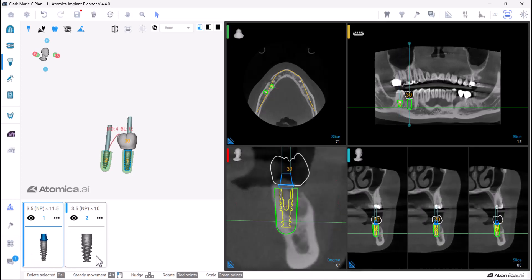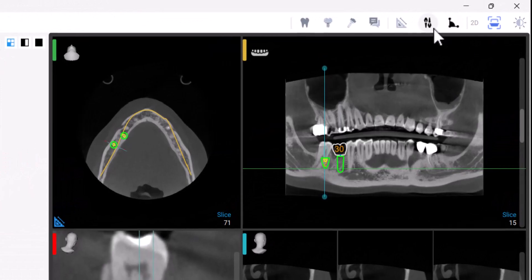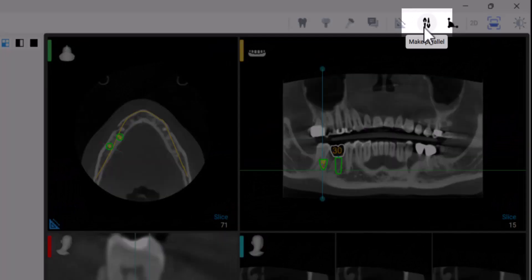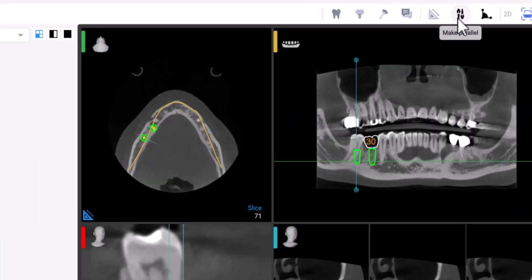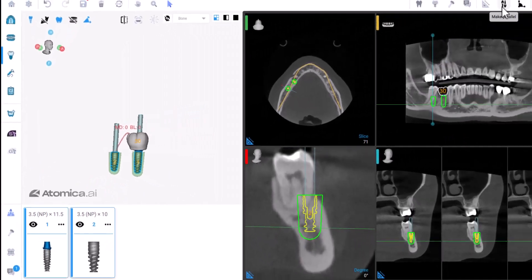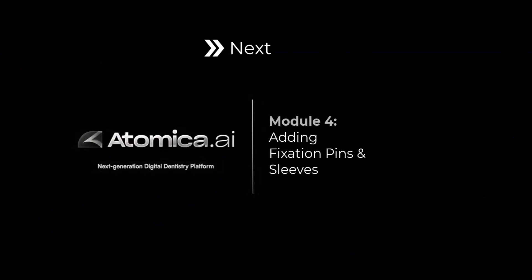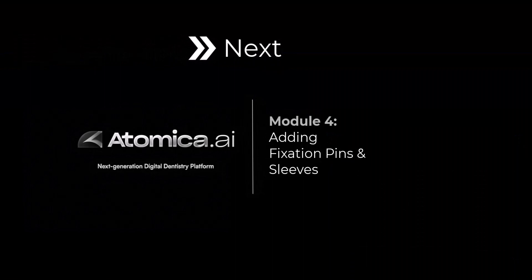Then click the Make Parallel button and it will be automatically adjusted. After adjusting your implant position, you are now ready to position fixation pins and sleeves for your guide.